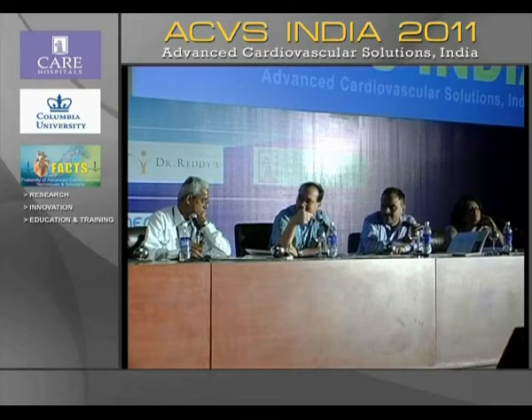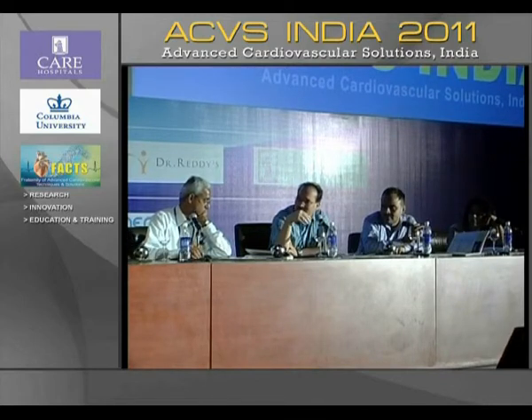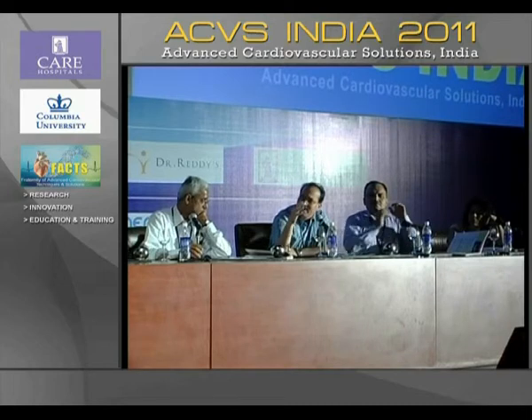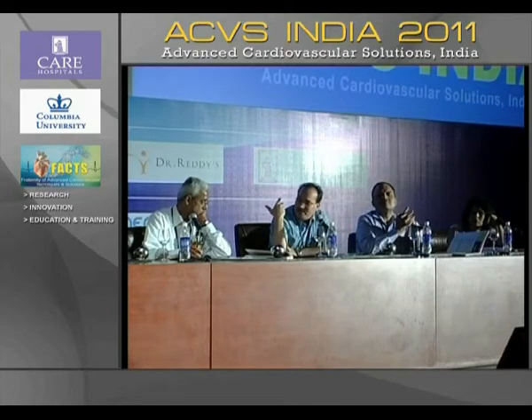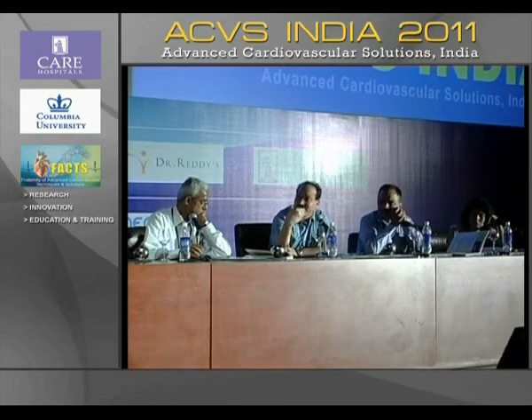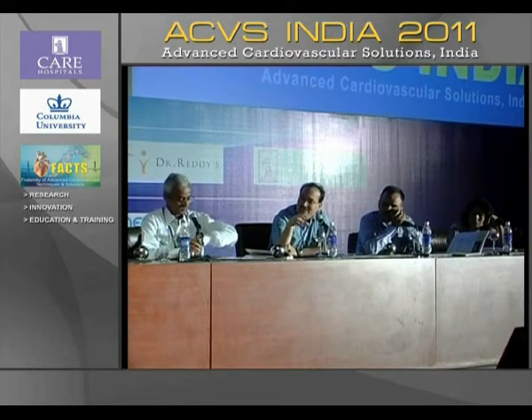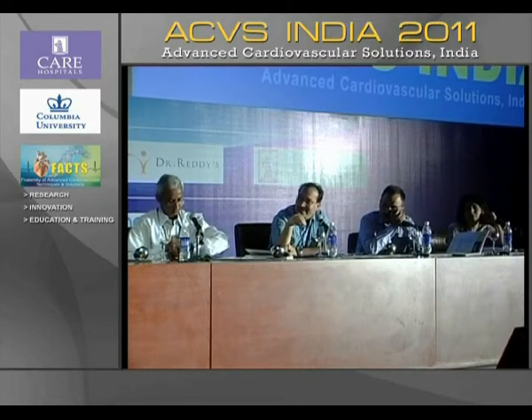You see that whenever you have perforation, you have to put the balloon first, so that you have the prolonged inflation of the balloon, reverse the heparin. And most of the patients, in fact, like the type of perforation you had, which was not very large, probably a large perforation would have collapsed immediately at the moment you would have removed the balloon. Most of these patients actually do settle without putting a covered stent.